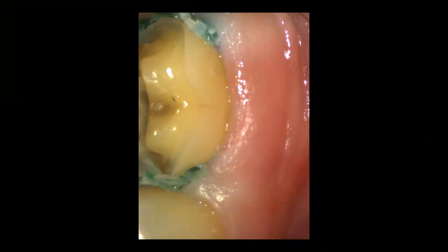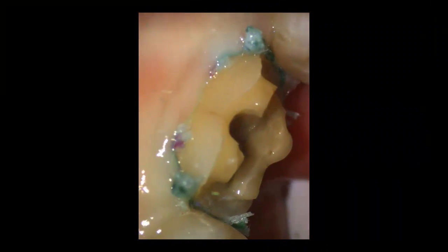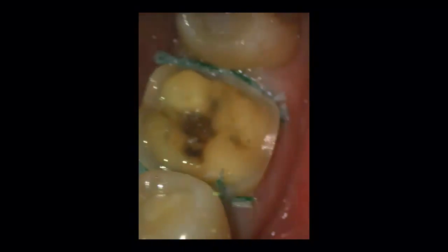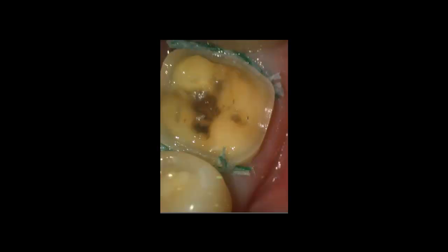I'm going to get this camera back up and roll over the other side again. You can see a pretty deep hole where the alloy was. But I found that this wasn't actually a good preparation because right here in this distal lingual corner, the software told me that it was too thin. If this had been done at the lab, I would have had to send it back — new impression and re-preparation, two weeks later come back and try it again. In this situation, I was able to go back in about five minutes, make a difference, just re-prep it real quick on that distal lingual cusp.